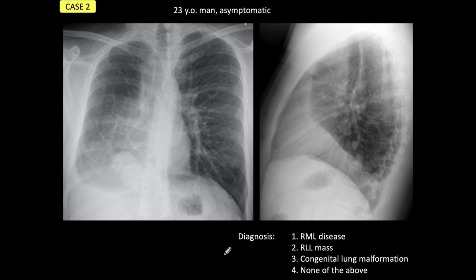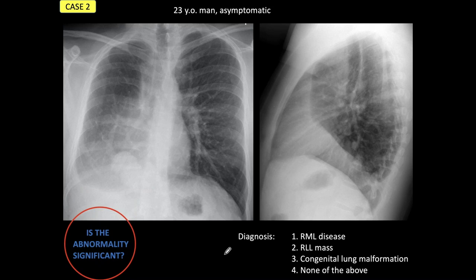Remember the first tenet: whenever we see an abnormal chest, we have to ask ourselves — is the abnormality significant? Stop the presentation at home, make up your mind, because this is a complicated case, but easy to diagnose if you know what you look for.